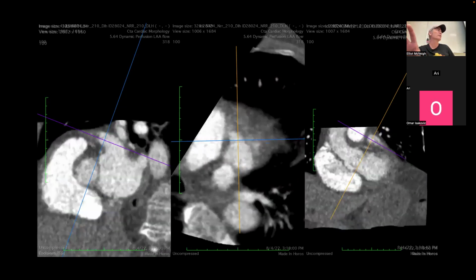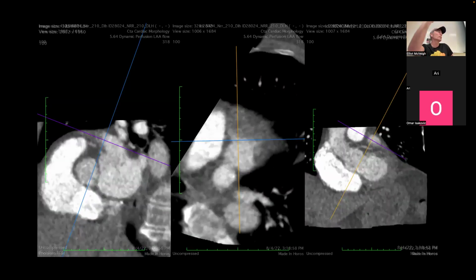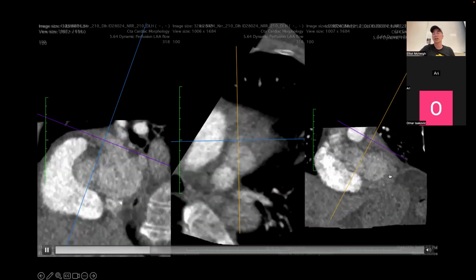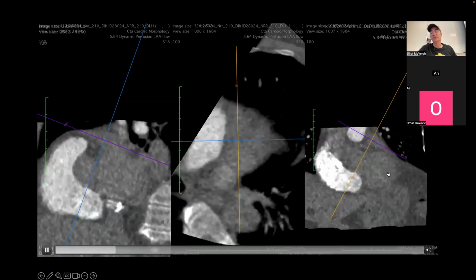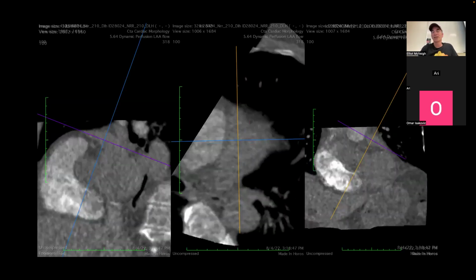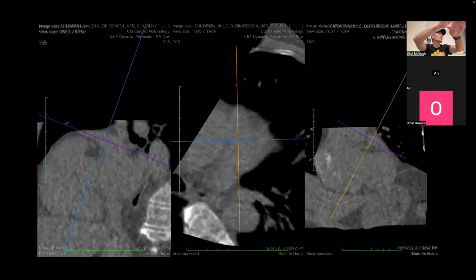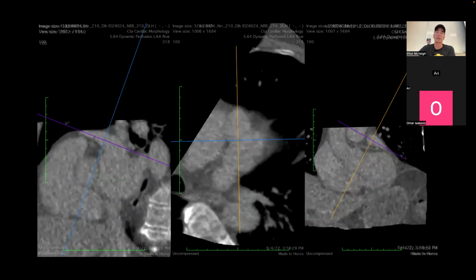There's nothing super complicated about this. It's just that you turn the mA way down, so it's like 50 mA or 100 mA, something like that. And you take multiple pictures gated to the heart, right? So we take them such that for each picture we're in end systole, and so the heart looks like a constant picture. Now, the one tricky bit is that if this is 27 images, it takes like 38 seconds or something for this to happen. The patient can't hold their breath. This picture has been corrected by geometrically deforming the picture such that it sits on top of a template picture, so every picture looks the same in space, right? That's a step that luckily the software had been written. We didn't have to write it.